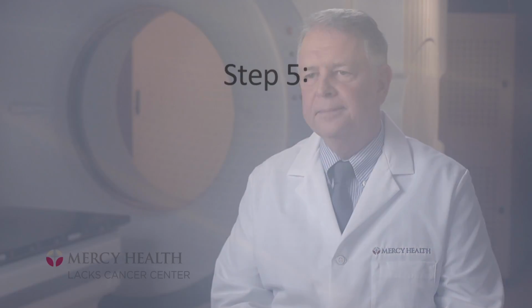The verification day generally takes about 15-20 minutes. I would recommend a patient to plan on a half an hour just in case we do need to make little minor adjustments. It really is ensuring the safety and accuracy of treatments of cancer patients that are getting radiation therapy.